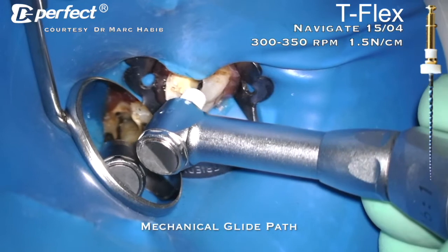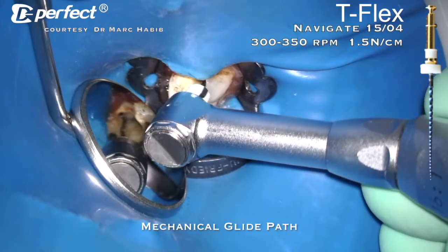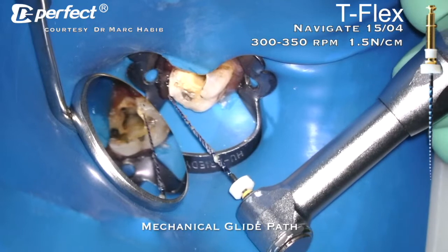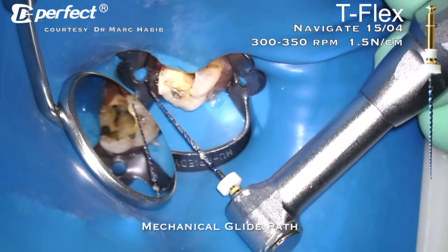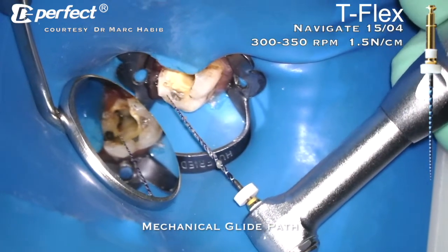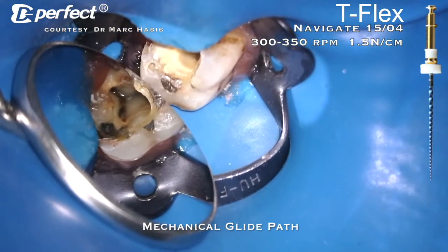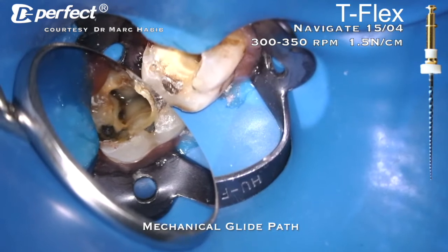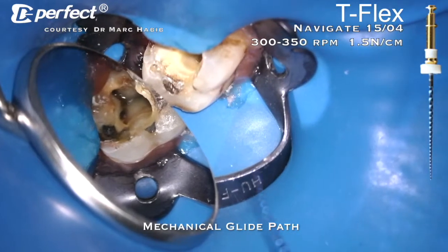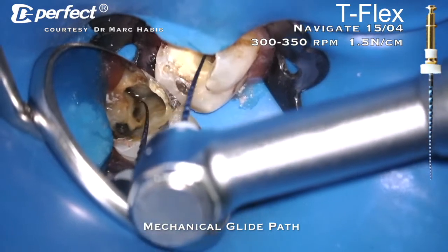Don't forget, this is a lower second molar, so the access is a little bit difficult. We can see the debris of dentine and pulp tissue on the file. And the file was cleaned and again pre-bent, and we can get to the canal easily.